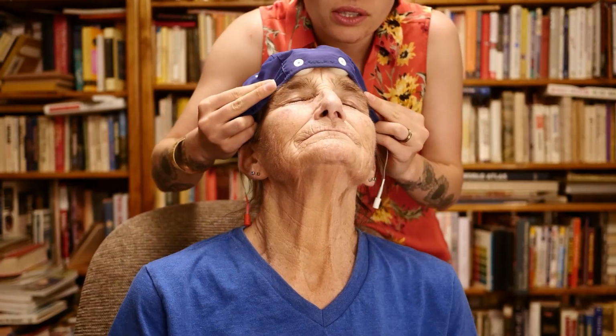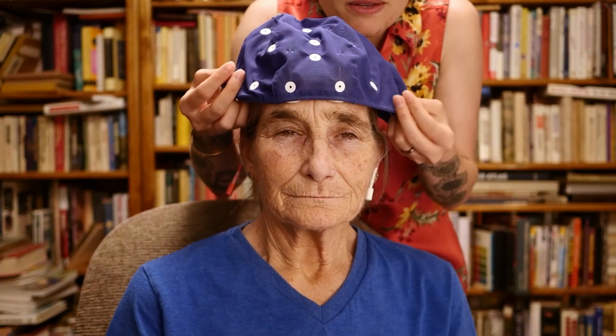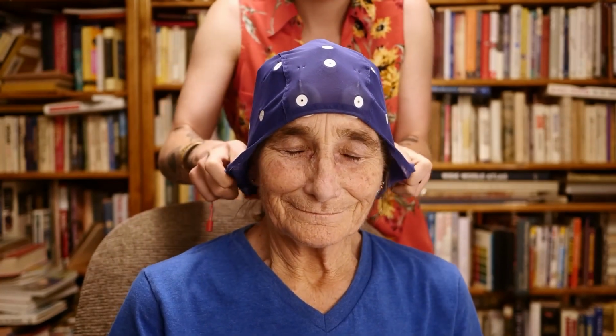Now go ahead and look at the screen for a moment. Perfect. Now, do you see that? The way they are just at the eyebrows. Here, point your face directly at it. Perfect. They are just at the eyebrows. They are right in the center. And, of course, they're not stuck to the eyebrows either. Very important there. And from that placement, we are going to settle the cap down onto the client, just like so.